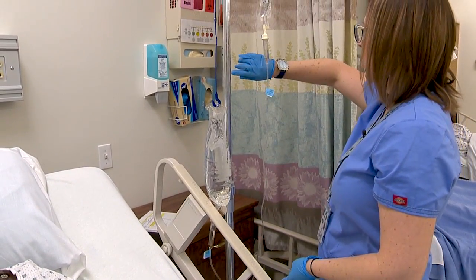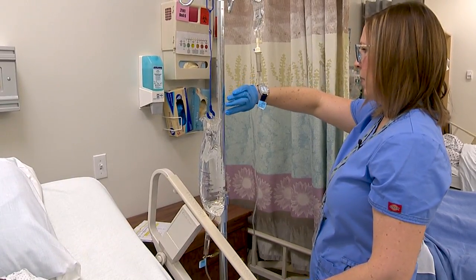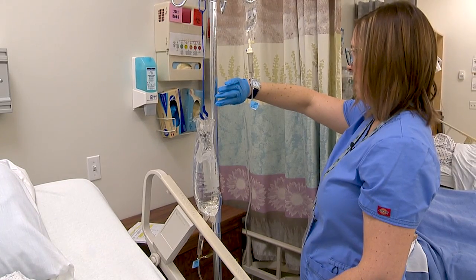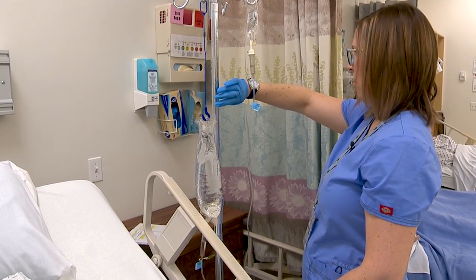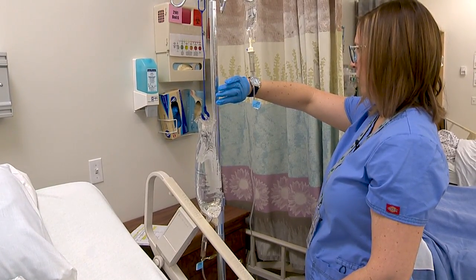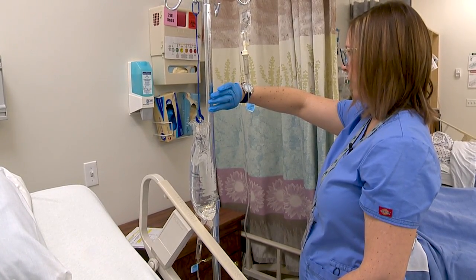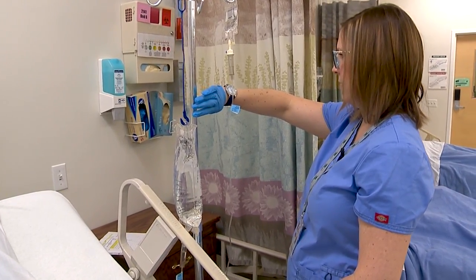Again, I need to be using my watch to count my drops per minute, which, if you remember, we had 2 drops per 15 seconds. Okay, it looks like we have our 2 drops per 15 seconds.